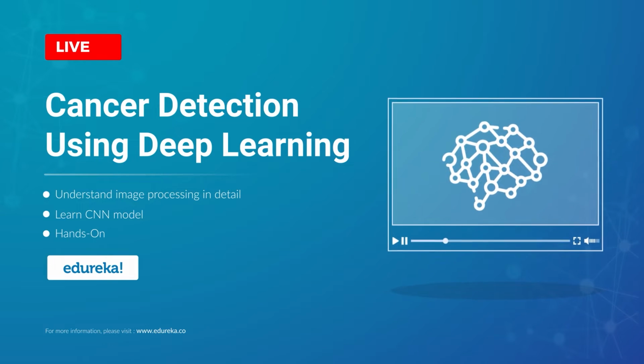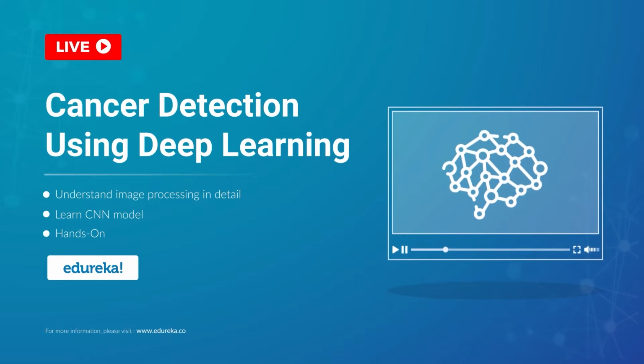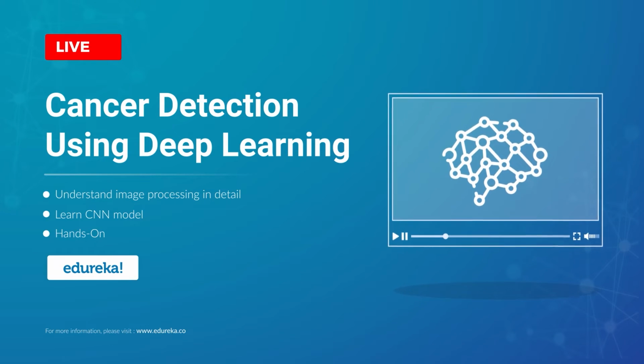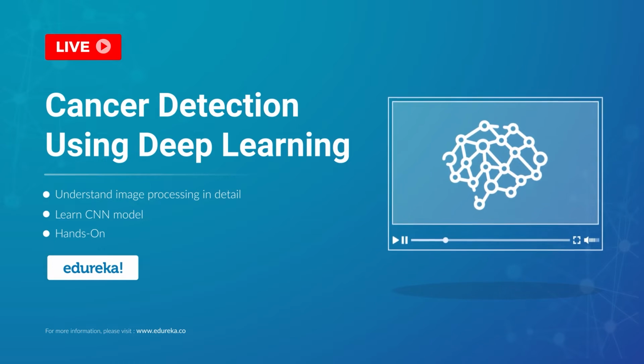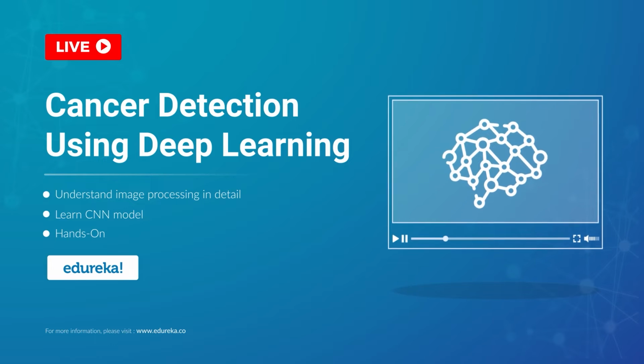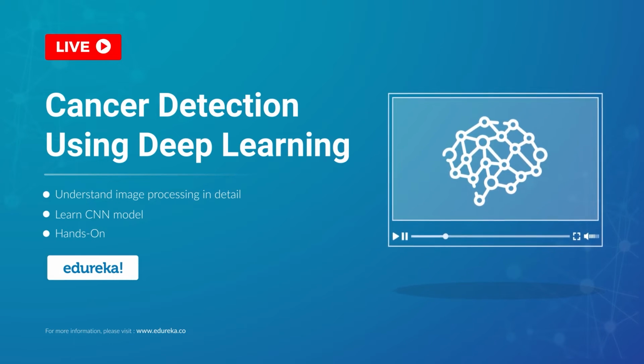Now in today's session, we will see how we can make use of deep learning and detect the brain tumor. So this session, I would rate it as an advanced session. I'll do my best to simplify as much as possible so that anyone with any level can get the overall idea of what we'll be doing, guys.